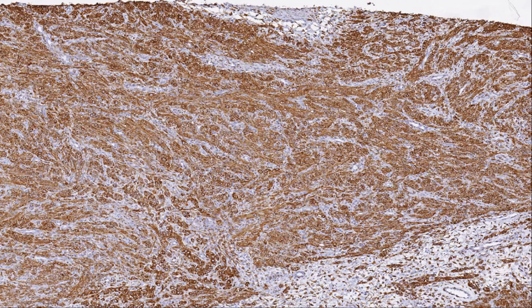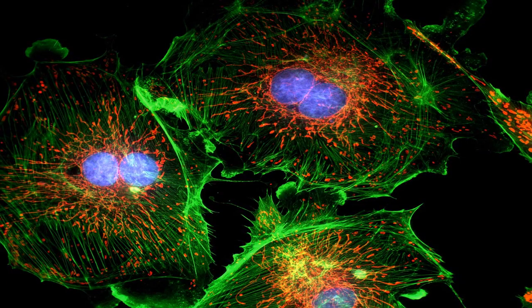Here, we tested specifically for a protein known as SMA, or smooth muscle actin. The cool thing about SMA is that it is only found in smooth muscle cells. Since most of the spindle cell population is staining for SMA, we know that the cancer cells originate from the smooth muscle, making this a leiomyosarcoma. So IHC is really important for finding extremely specific things in tissue samples.